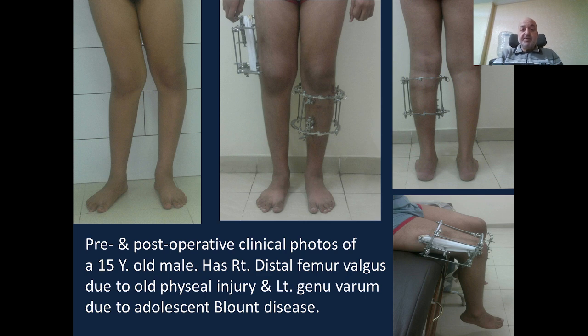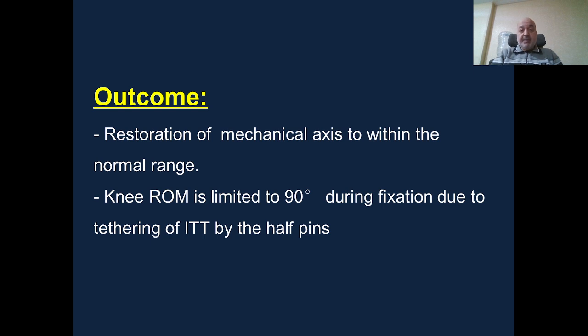Another case of wind-swept deformity. We used our simplified techniques for both the femur and the tibia. And as the outcome of our technique, we achieved restoration of the mechanical axis to within the normal range.